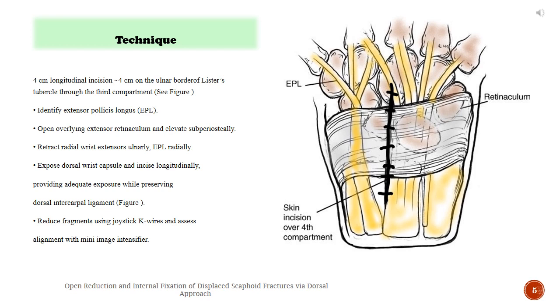Providing adequate exposure while preserving dorsal intercarpal ligament. Reduce fragments using joystick and K-wires, and assess alignment with mini image intensifier.